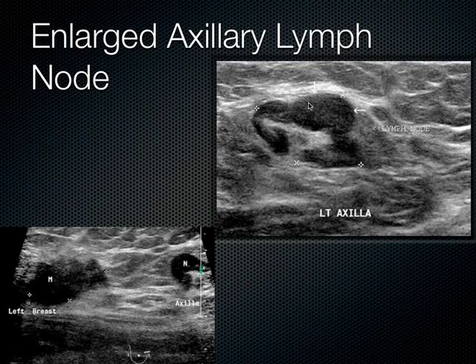So we can see this lymph node involvement along here, and so when you get metastases to the lymph nodes, you look up in the axilla, this is the kind of thing that you can see, this very abnormally shaped lymph node with these lobules to it. It's very enlarged, I would just generally say, very enlarged lymph node. And the same thing's going on over here.